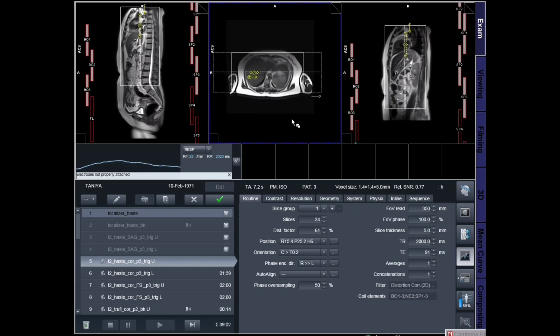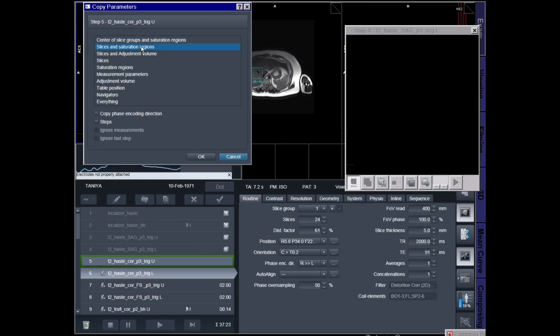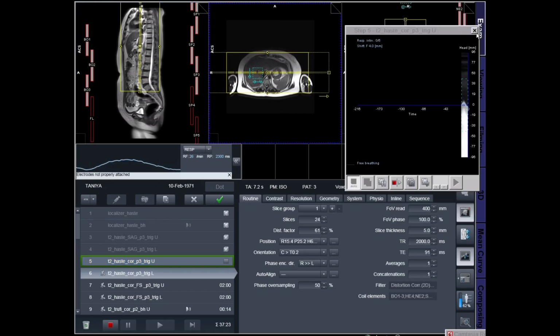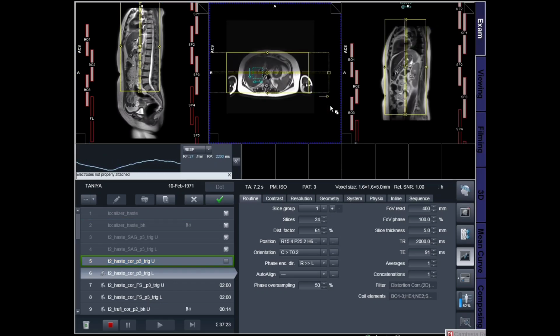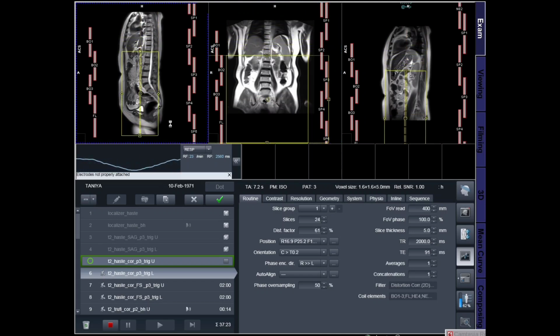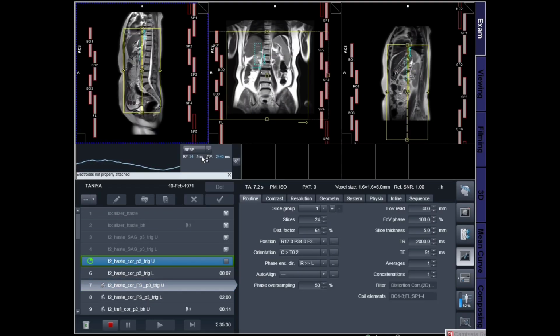Patient preparation. Before performing MRI, proper patient preparation is essential. First, it is important to check for MRI contraindications, such as pacemaker, cochlear implant, aneurysm clips, or other metallic implants. Patients are usually advised to maintain 4 to 6 hours of fasting to reduce bowel motion and improve image quality. The patient is positioned in the supine position, and a phased array body coil is placed over the abdomen.